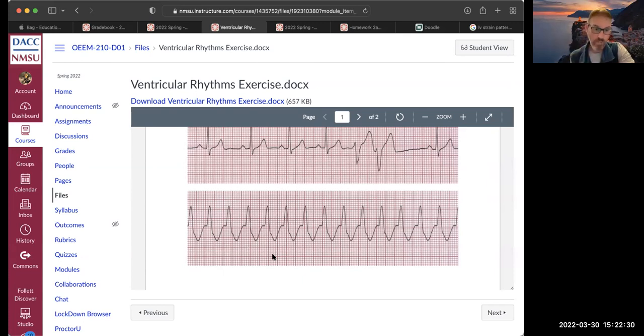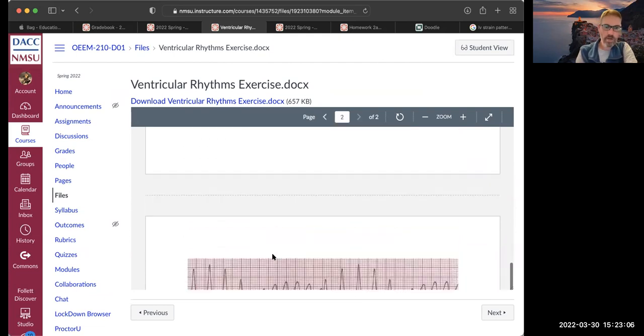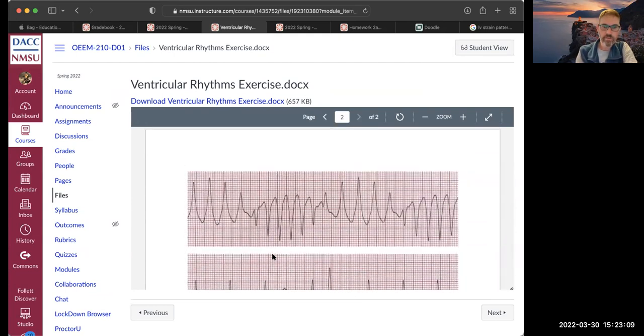And that goes into something called Occam's razor, where when you are looking at different differentials, the differential that requires you to make the most assumptions is generally not going to be the right one to go with. Again, we're speaking in generalities here. So this is more likely to be VTAC over SVT, given the available information. Let's see, everybody did pretty good there.